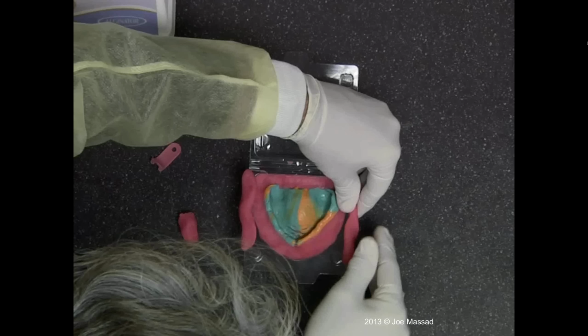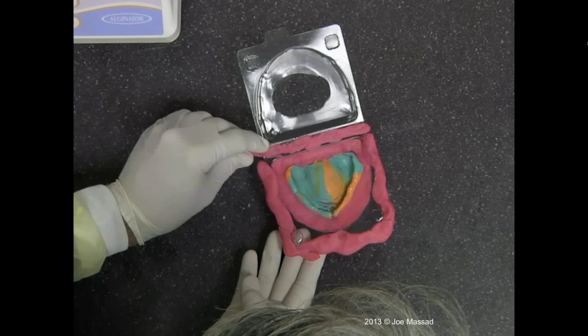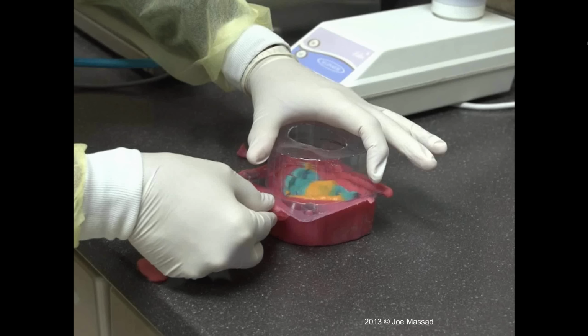Now, when I close this, you'll see that I should have it sealed. Sometimes some of the material will come back in. Just put your finger back into the orifice at the top, and you can push the area around the peripheral border and just make it nice and level. So sometimes a little excess when you close this will hold. You can clean it up.